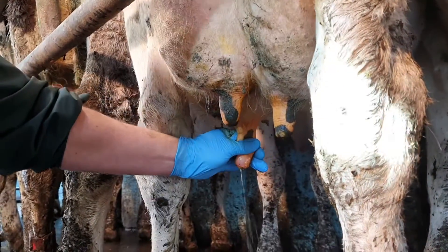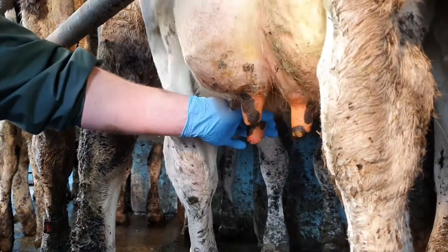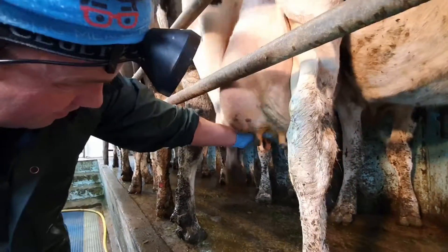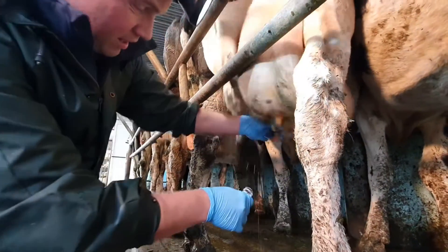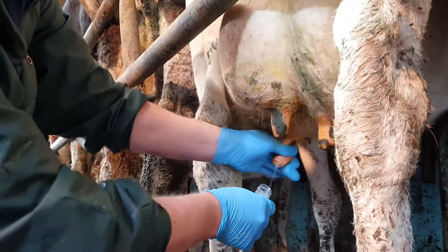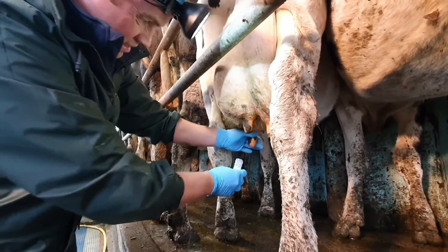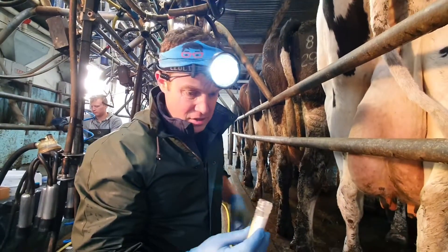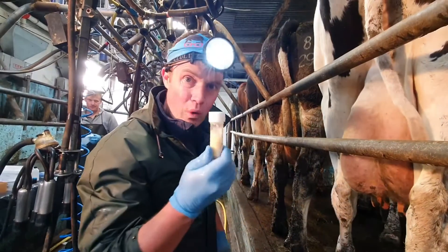Now the next thing I'll do is take some of that mastitic milk and get it on the ground. Then I want to get my tube and I'm going to half fill my tube. The teat end is clean. I have my mastitic milk sample. I don't want any environmental pathogens getting in there - I want to keep it as clean as possible - and I can culture this milk now to find out what the pathogens are.